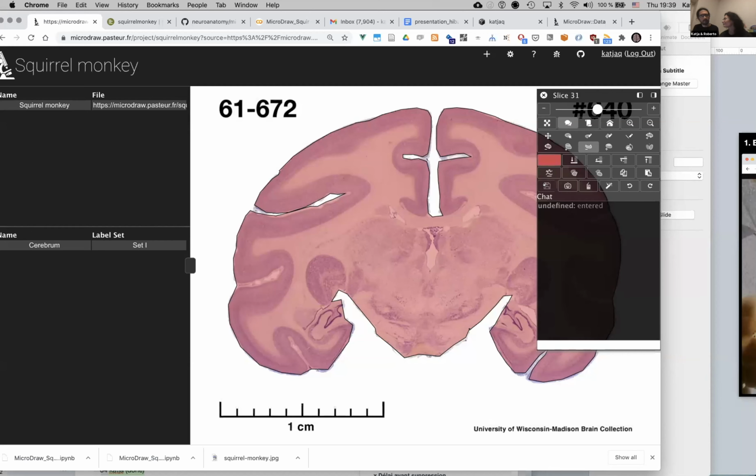Then you provide that in a JSON file. It would be good that you measure what corresponds to 1 centimeter, and that's the information that you have to add, and that's it.